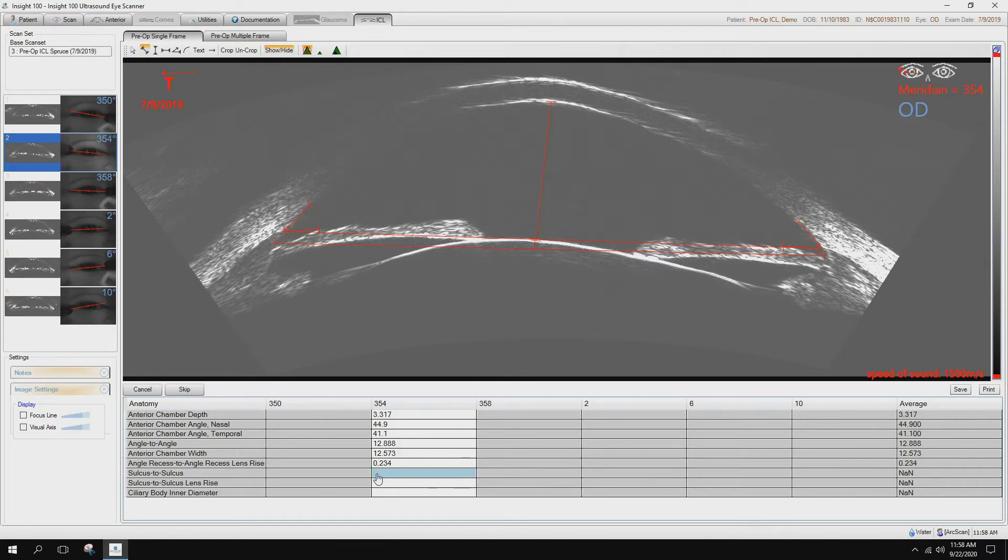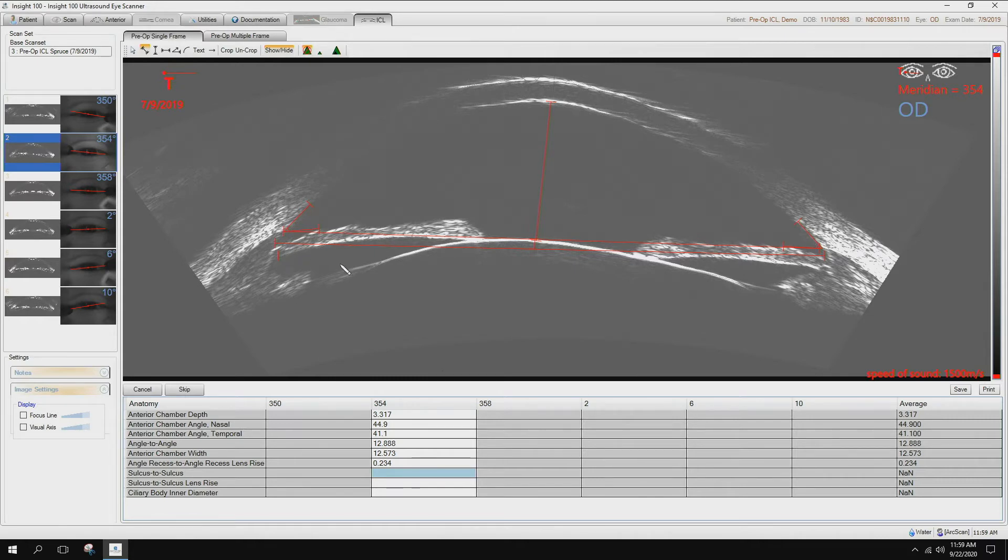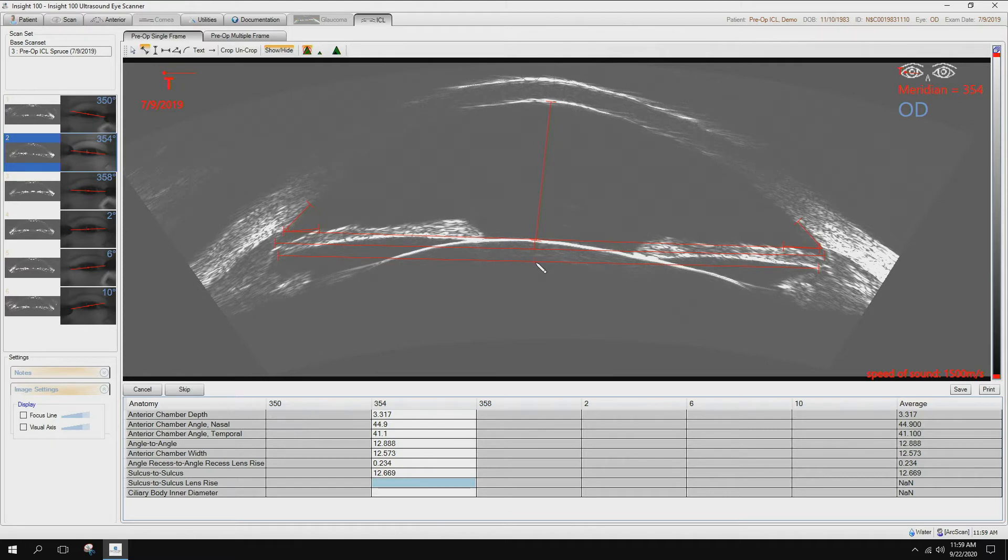The next one is the sulcus to sulcus. This is defined by the pigmentation on the posterior side of the iris. Sulcus to sulcus lens rise, again here, up to there.